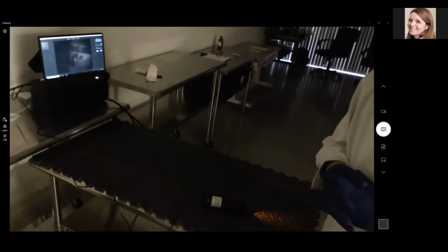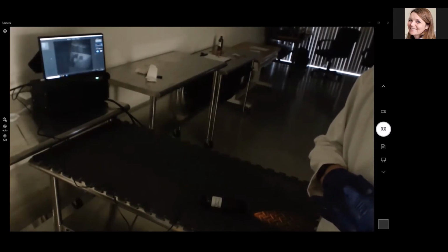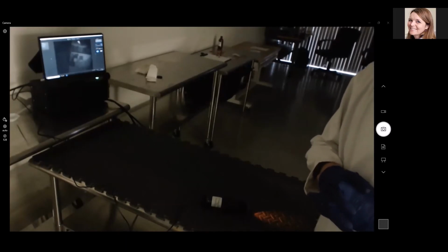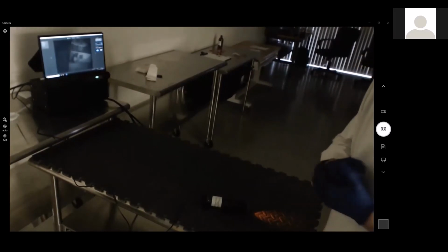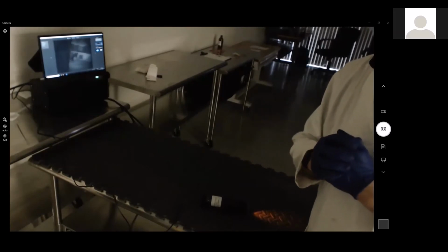The aiming component of some of the other cameras is almost like night vision goggles, right? So whatever the wavelength is, probably working in the high 600s, 700s. Yeah, and I would say that's probably less intense on the patient as well.